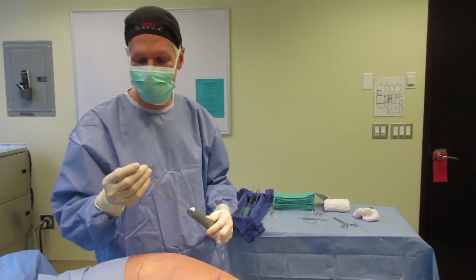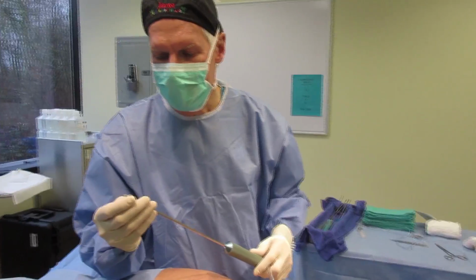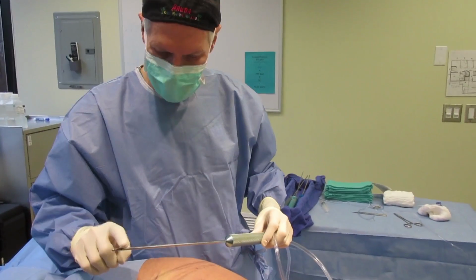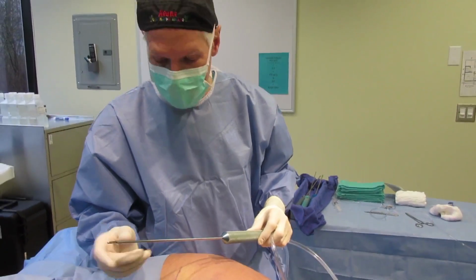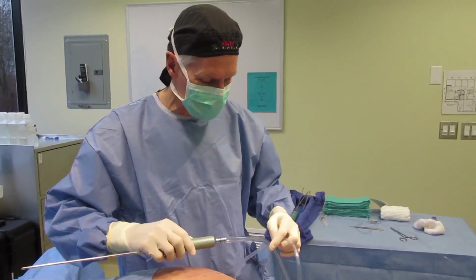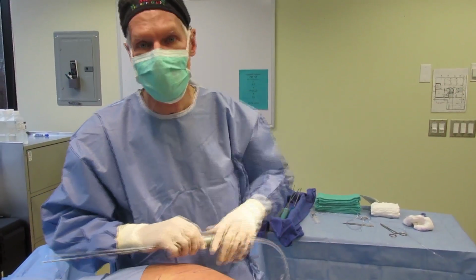If I step on the suction, it makes for sucking at the end of these little holes here. And this cannula is passed through fat, and it clips the fat off, sucks down the tube, sucks into here, and then swirls around and goes into the canisters.